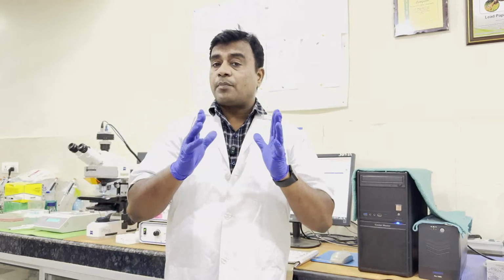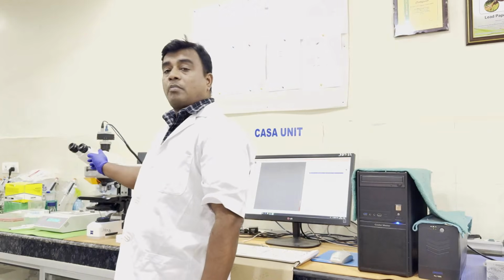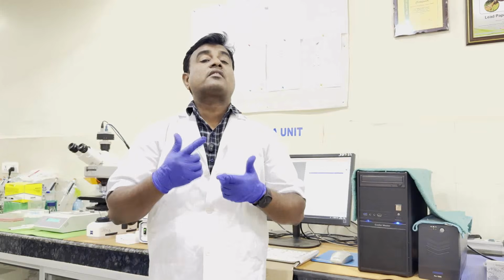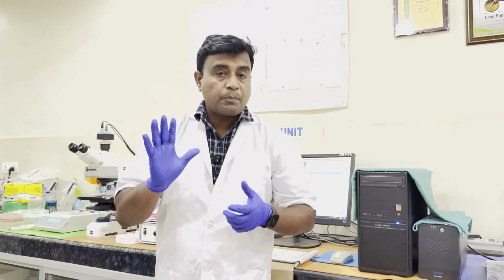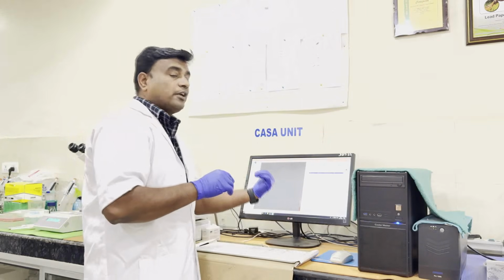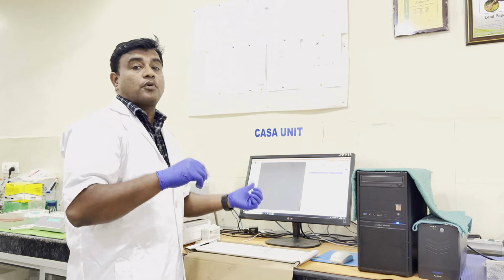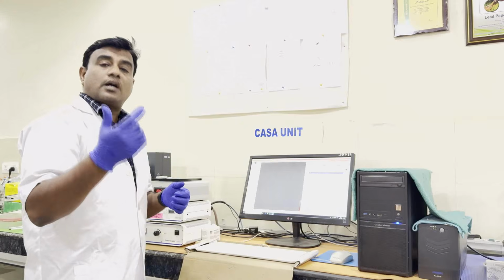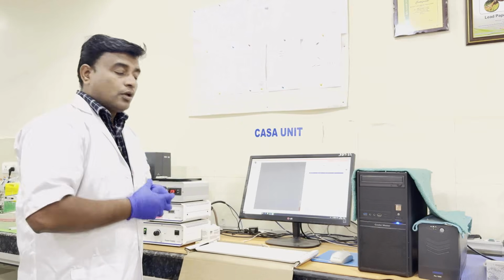But for this type of staining, you require your microscope to have fluorescent filters and broadband filters or individual filters, so that they can take the excitation and emission spectra and send them to this computer so that the software can utilize them. So these are additional assignments with the CASA and upgraded systems.